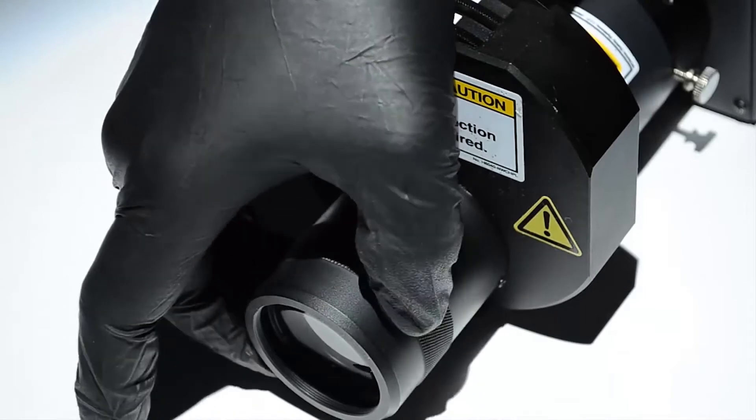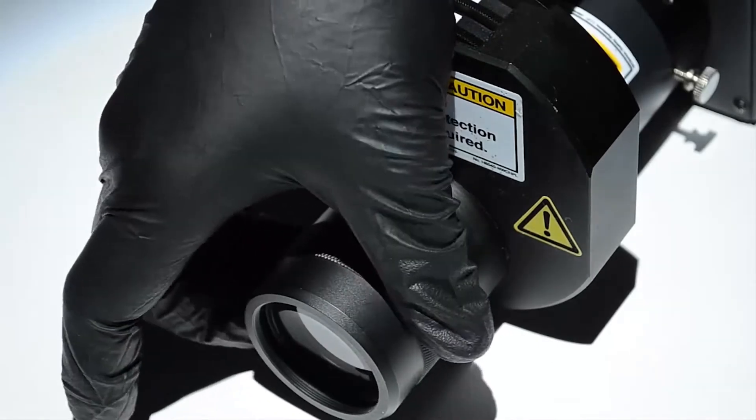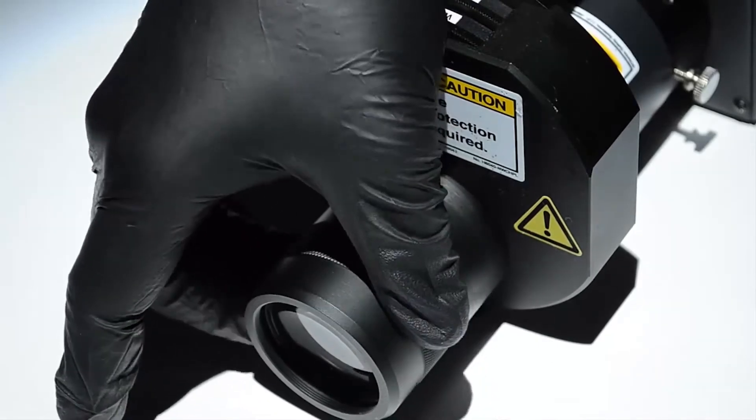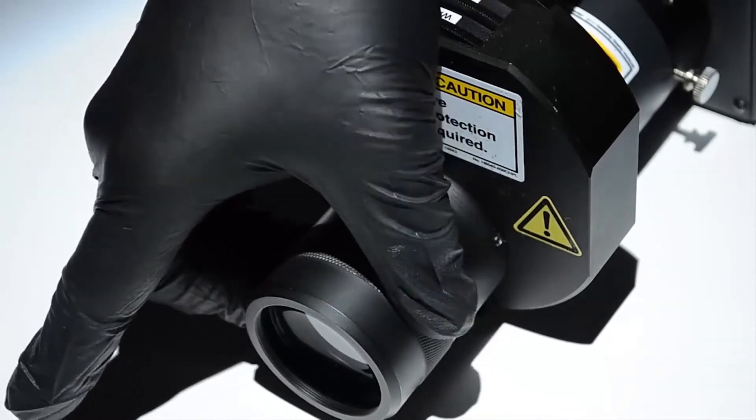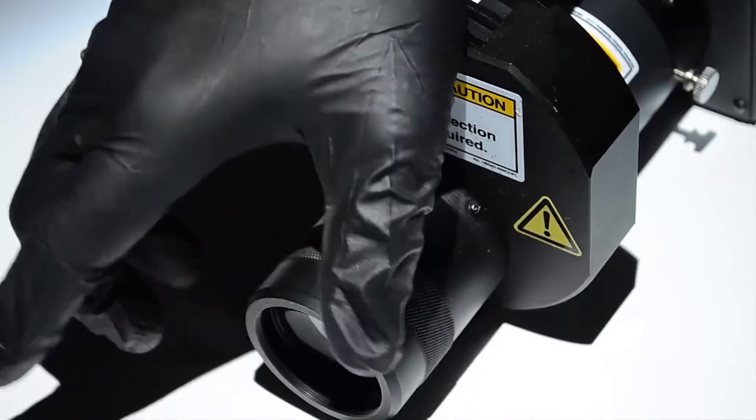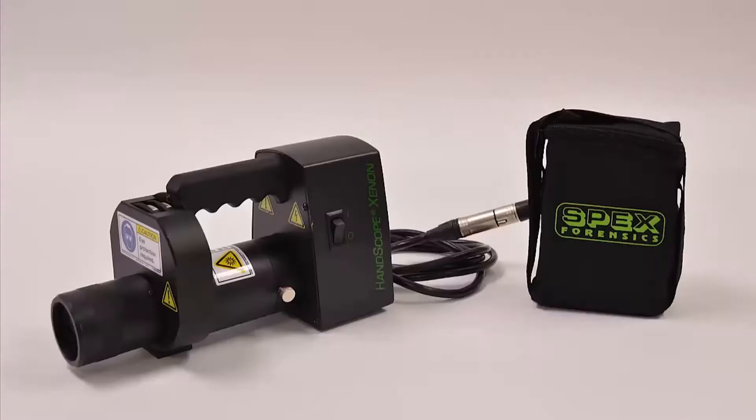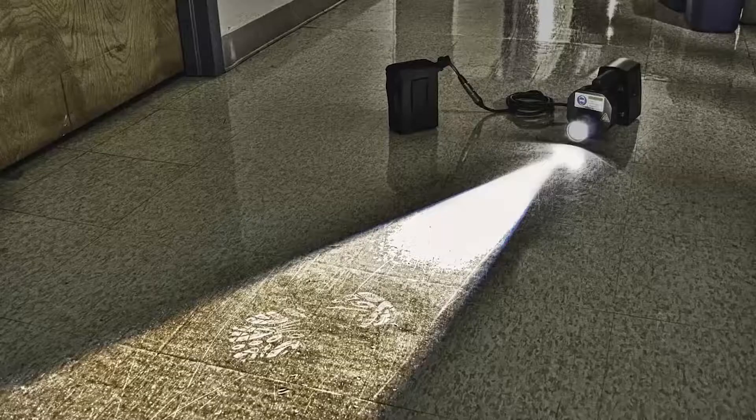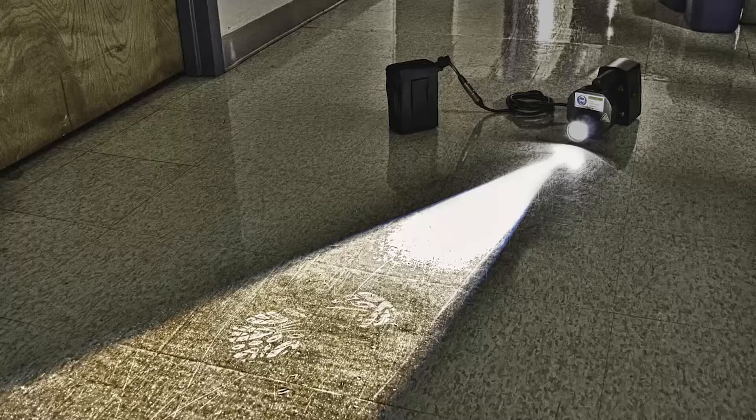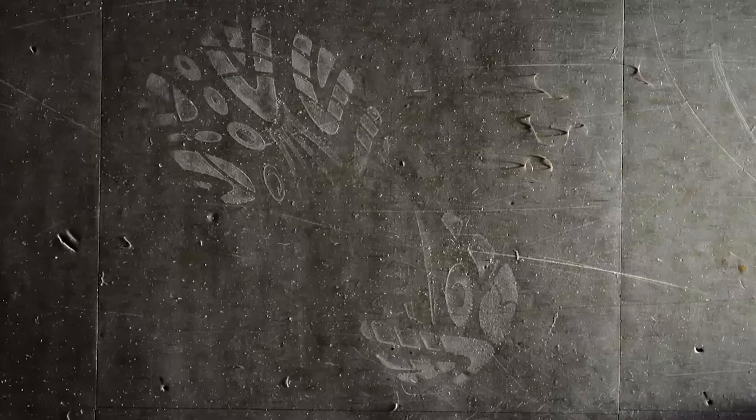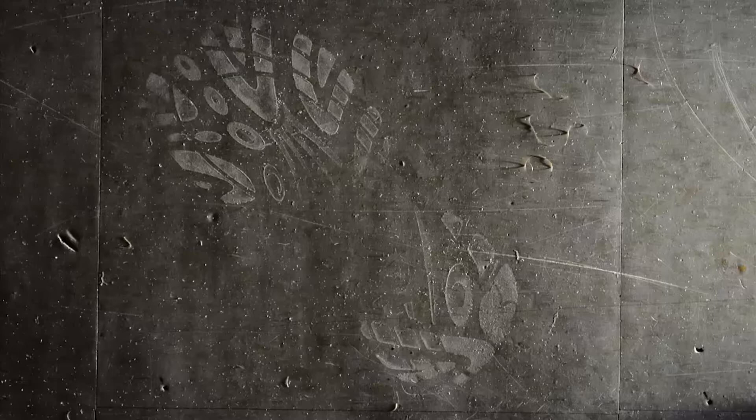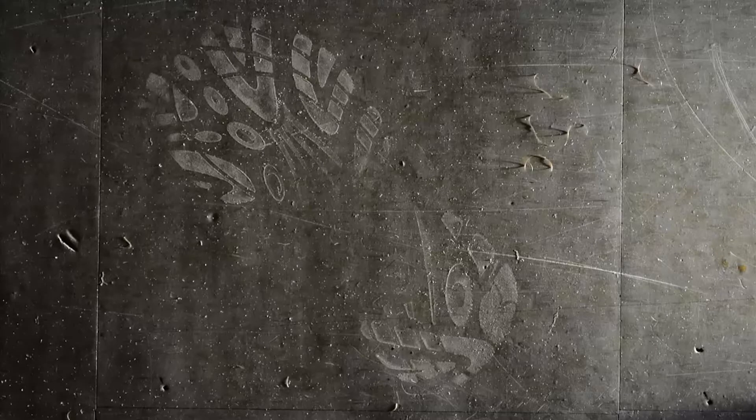A fully adjustable collimator. Depending on your working distance, the spot can be adjusted for a nice evenly defined image. AC-DC power with run time of up to 2 hours with the optional lithium ion battery. Low profile design for oblique lighting when looking for footwear, hairs, fibers, and other trace evidence.